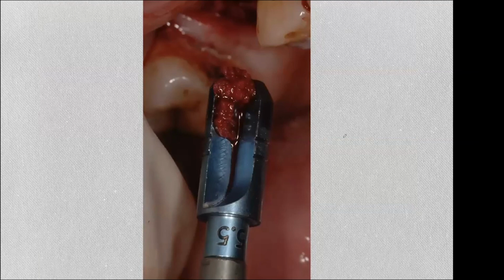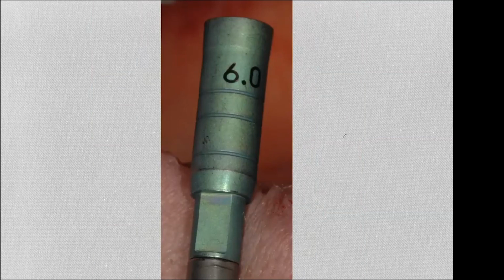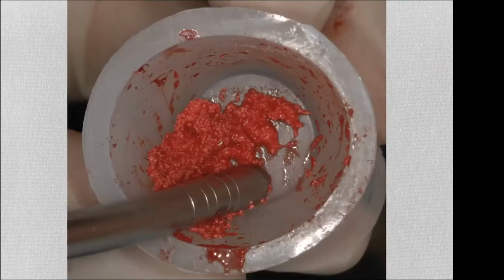We're collecting all of that bone, but all of it is really mostly sort of osteoid and the clot. We set those aside. This is the 6 millimeter, and we take the 6 millimeter sinus floor osteotome with this little flare, introduce it into the osteotomy, and we tap it, and it fractures fairly quickly. We mix the SynthoGraft with the bone. It is plentiful, and it was fairly wet, so we got to sort of a slurry stage.